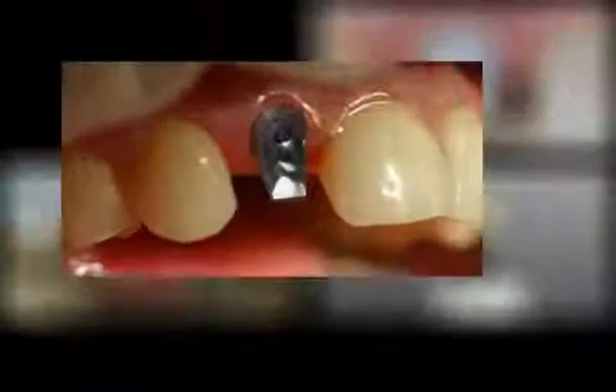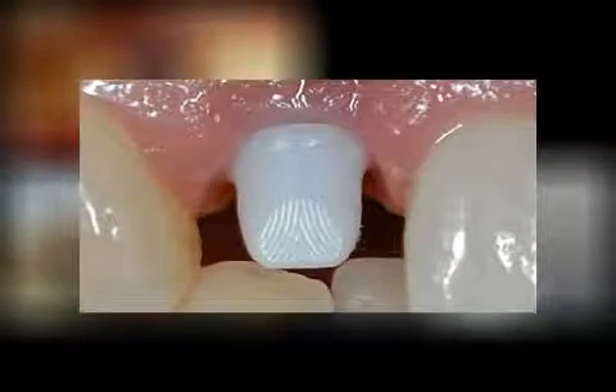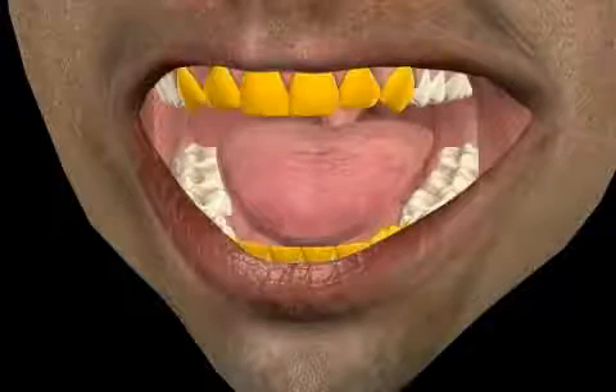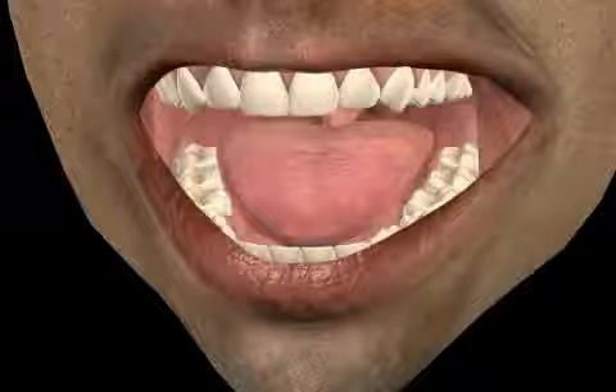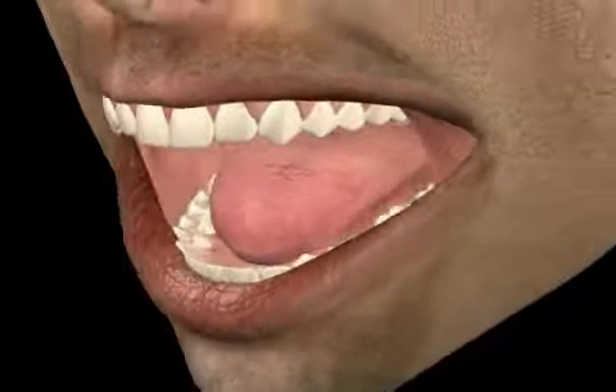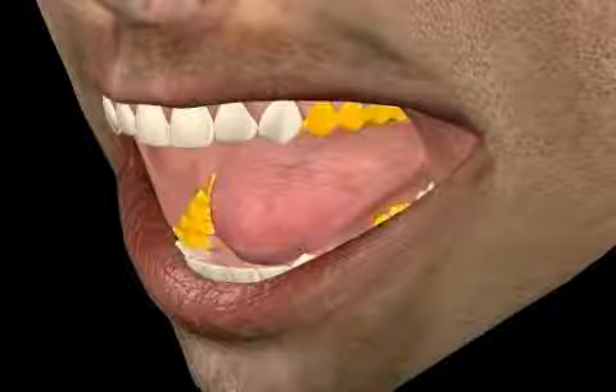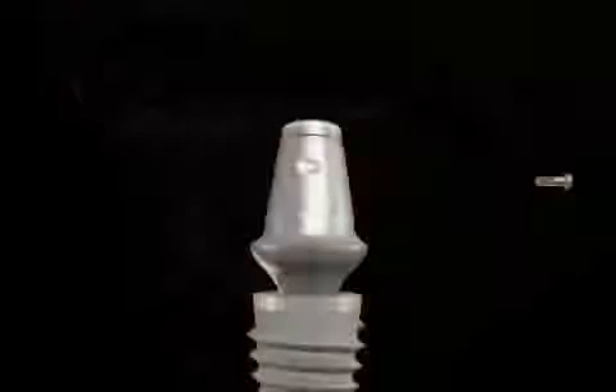You see a titanium abutment sticking out from the gums. Next to it you see a zirconium abutment for comparison purposes. Zirconium abutments are usually used in the front of the mouth because they allow for better gum aesthetics. Titanium abutments are cheaper and more stable and should be used in the side teeth area.